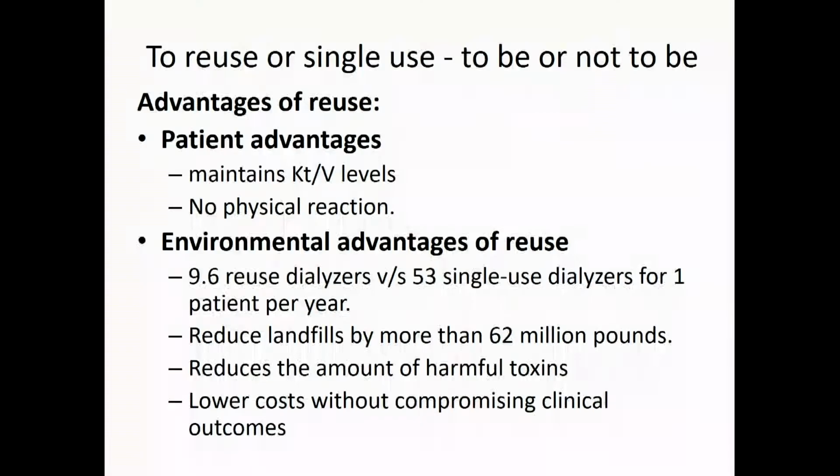So how many units actually follow this? Lot of variabilities. You'll have to put peracetic acid in that and keep it before you. So it's not common practice to follow that dictum.